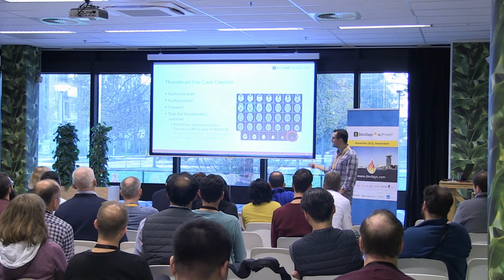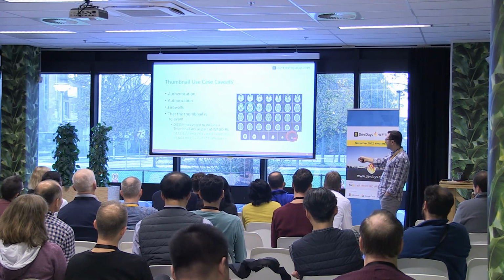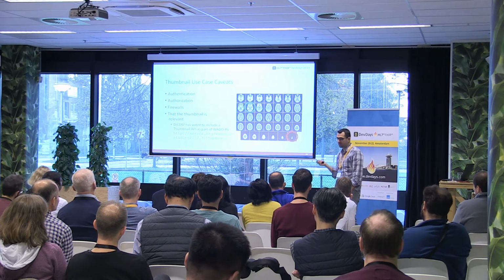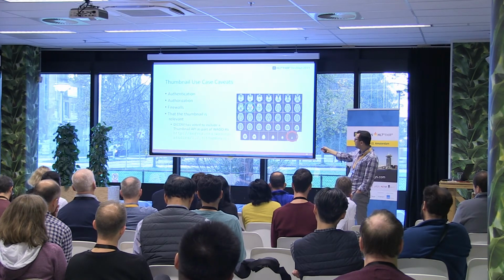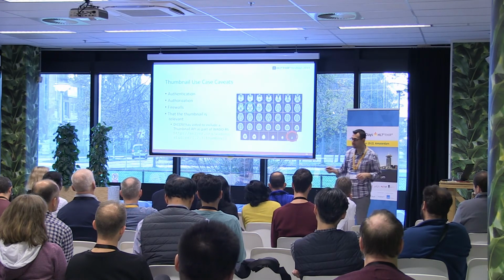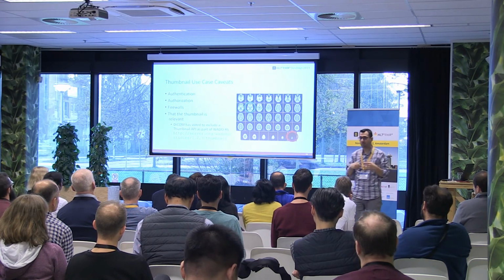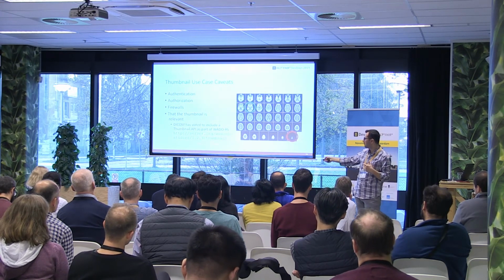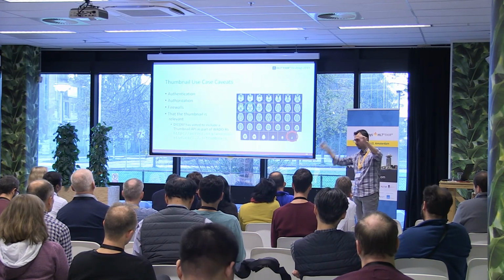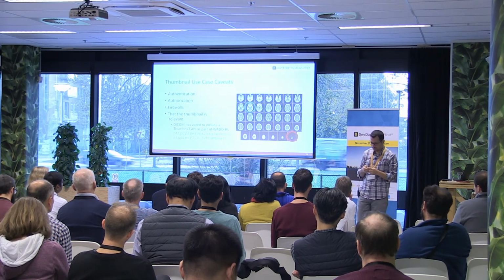How do you decide that a thumbnail is useful, right? Like, do you just take the first one or do you take the last one? Because the first one and the last one in this case don't really tell the clinician anything useful. Well, the one they're looking for would be somewhere in the middle. Obviously, it's not the fifth one every time. It all depends. So that's why within the DICOM standard, there's now a new amendment to the standard for a thumbnail service where you could say, give me a thumbnail. So you're asking the other system, pick a useful image from this series and give it to me instead of you trying to decide. Okay?